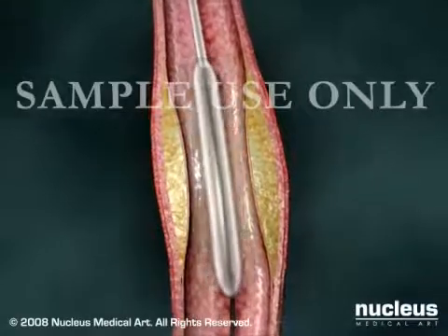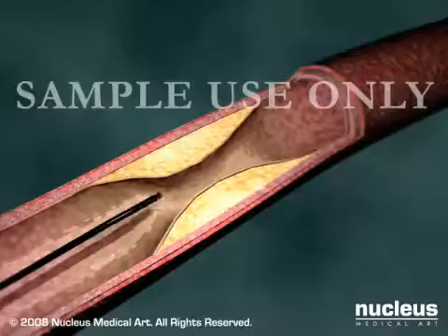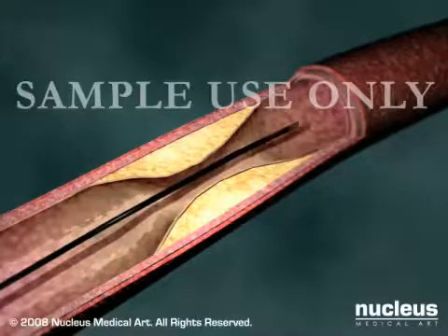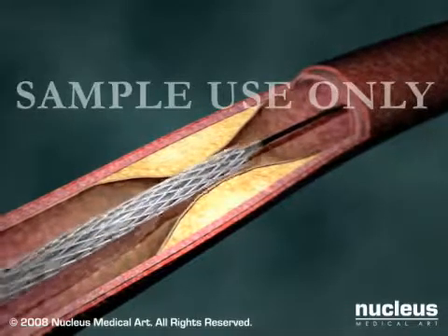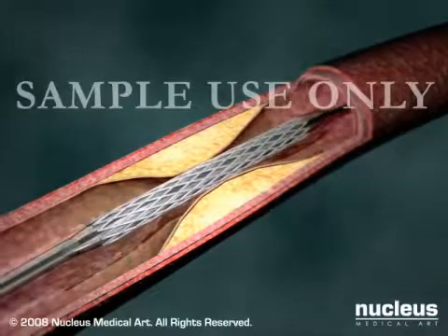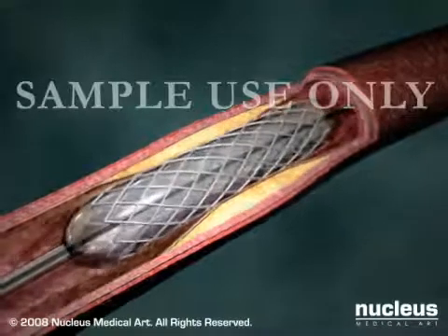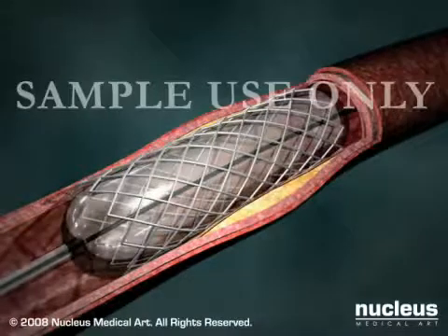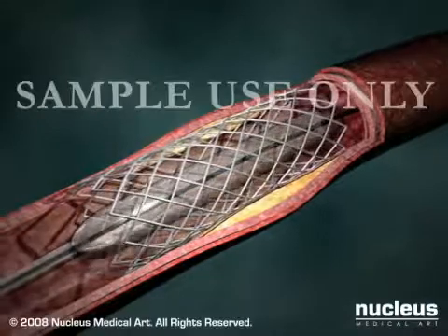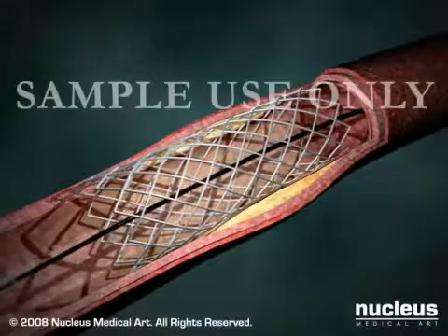Afterwards, your doctor will withdraw the deflated balloon and catheter from your arteries. Some patients will receive a coronary stent, which is a small tube made of wire mesh designed to prop open the artery once it has been treated. A collapsed stent is placed over the deflated balloon as it's moved into position. When the balloon is inflated, the stent expands and locks into place. After the balloon and catheter are withdrawn, the stent remains behind to hold the artery open permanently.